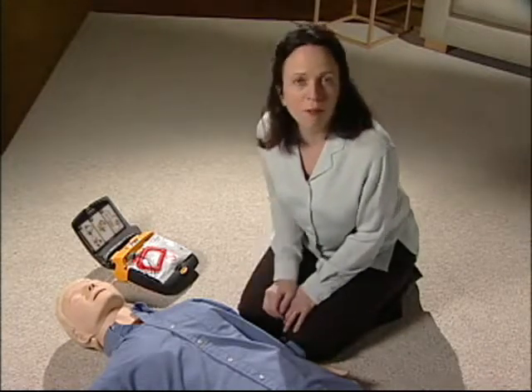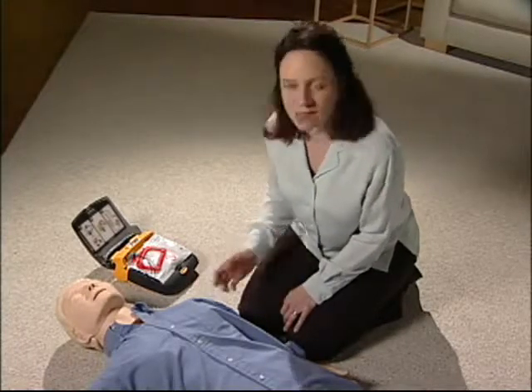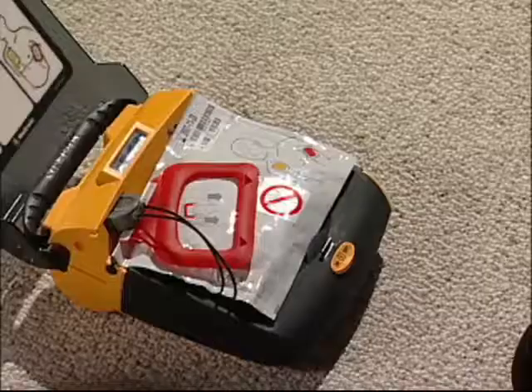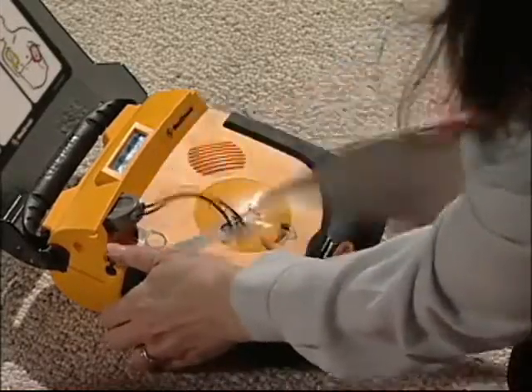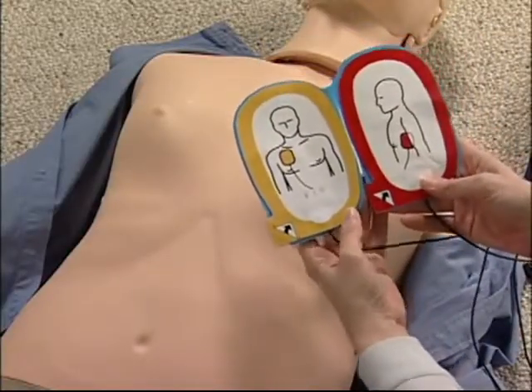Some versions of the Lifepak AED come with a kit that has a pair of scissors, but in this case, the fastest way is to just tear open the shirt. Pull red handle to open bag. These are the electrode pads. Look at pictures on pads.